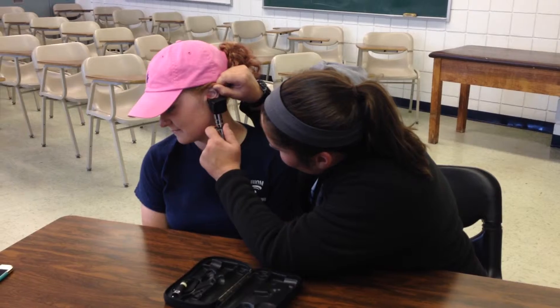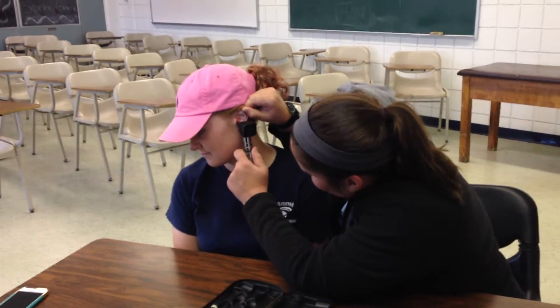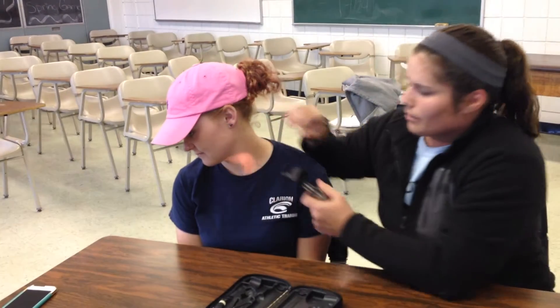You're looking for the tympanic membrane, which I can see right now. I'm also looking for any fluid or inflammation of the ear for infection purposes. You never want to insert the tip blindly — whenever you're doing this you could hurt the patient. If there's any pain then you have to stop and go back. You're looking for color and clarity of the inner ear, and this is how you use an otoscope.